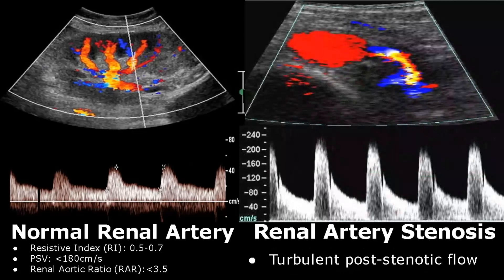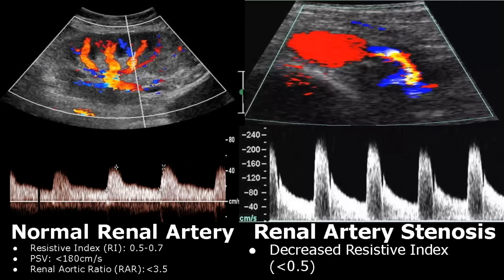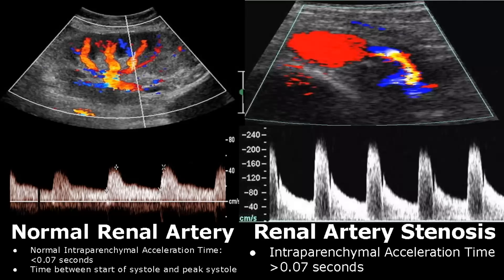Turbulent post-stenotic flow is another feature of stenotic renal artery. We can see color mixing here, indicating turbulence in this region, with PSV above 200 centimeters per second. Renal artery stenosis will also have a decreased resistive index, below 0.5. Intraparenchymal acceleration time is the time between start of systole and peak systole. Normally this should be less than 0.07 seconds, but in renal artery stenosis it will exceed 0.07 seconds.